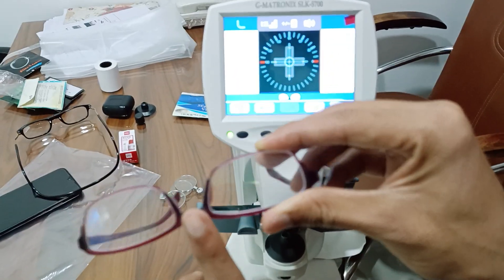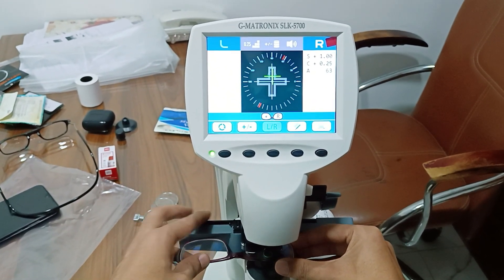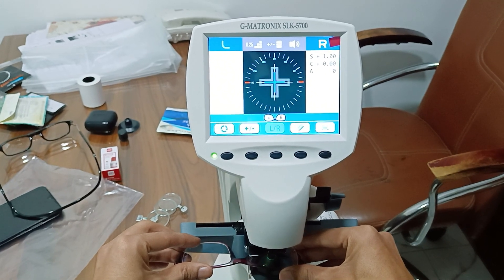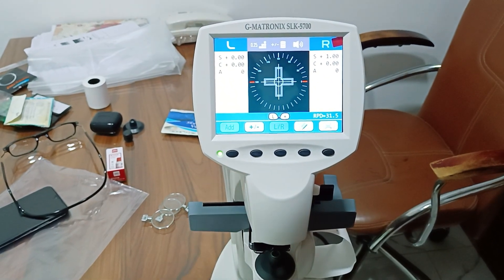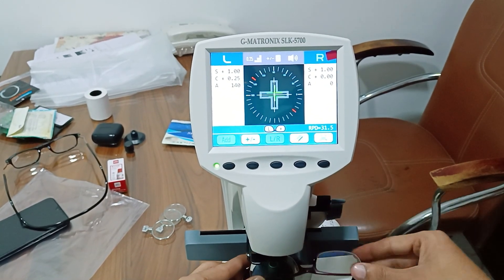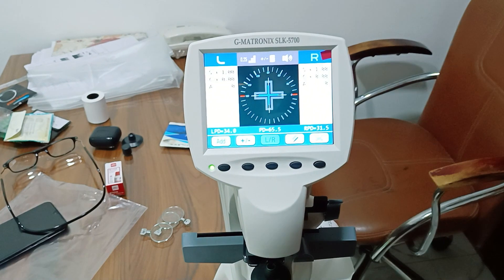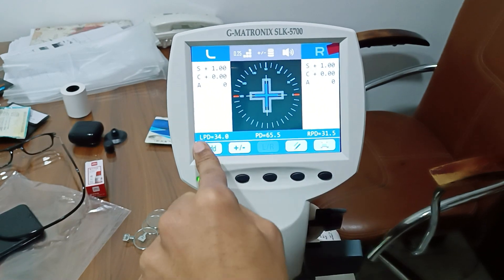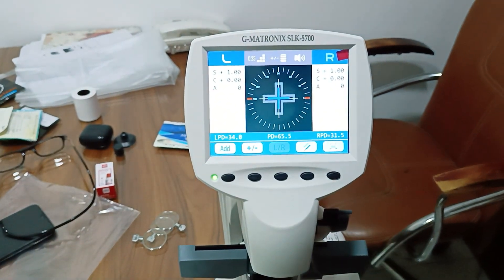Now I will take PD measurement. Right PD — okay. Left PD. LPD, RPD, and total PD are all available: LPD is left, RPD is right, and total PD of this glass is shown at the bottom.